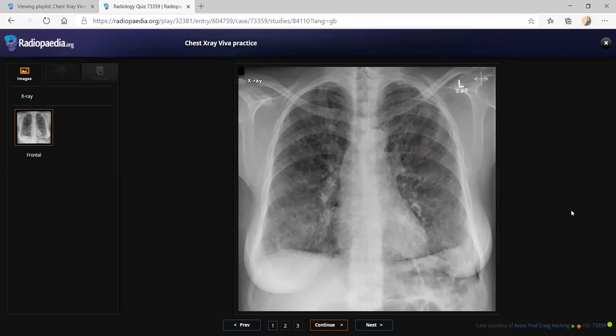Now the chest X-ray is showing an appearance of interstitial lung disease of UIP pattern. I'm looking for any dilatation of the esophagus or cutaneous calcifications to suggest scleroderma, which I'm not seeing. I said the volume of the lung appears preserved.